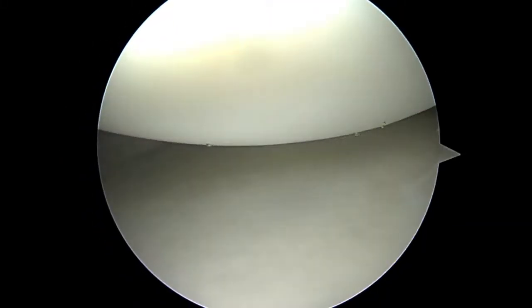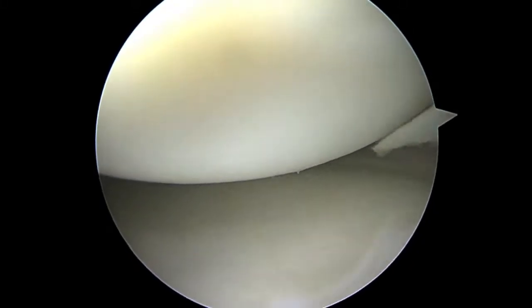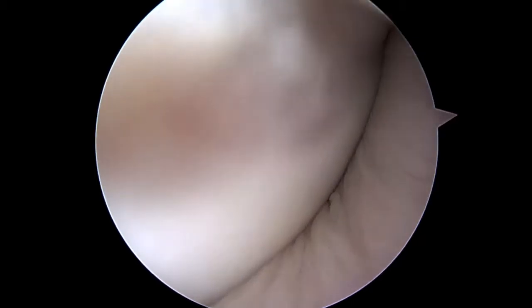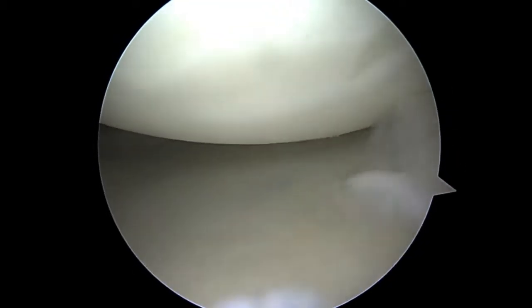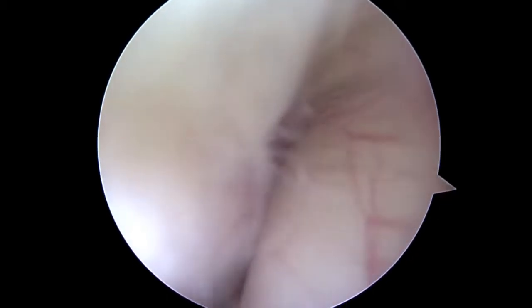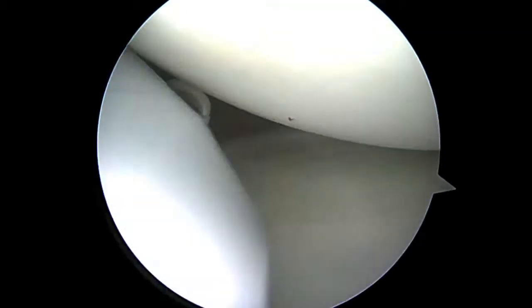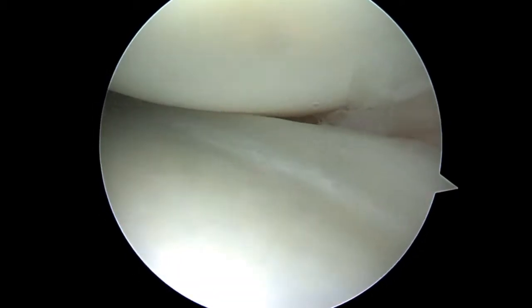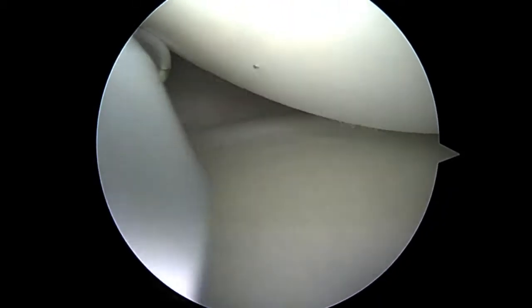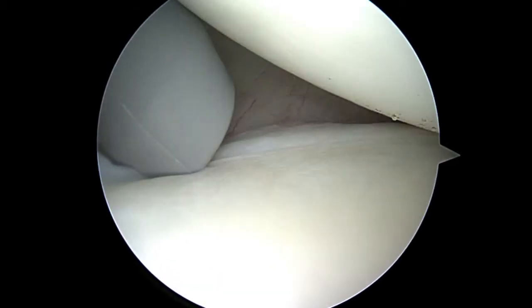I'm going to rotate a little towards the back of the shoulder. Like I said, you can get some instability posteriorly. It doesn't really look that loose back here, but we're going to look from the front to the back in a minute. More than likely, we're going to be putting an anchor in down at 5 o'clock and at 7 o'clock to tighten up the inferior glenohumeral ligament.